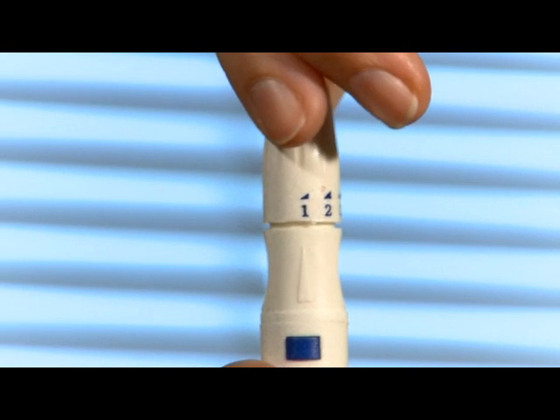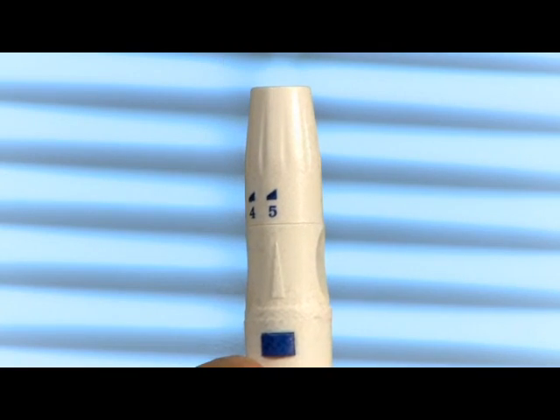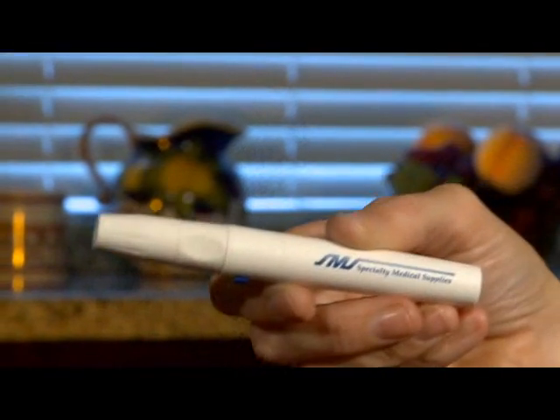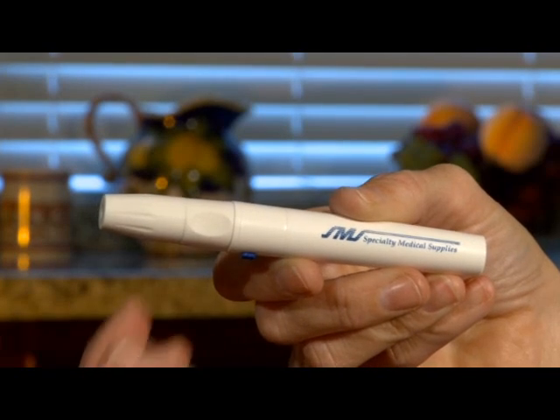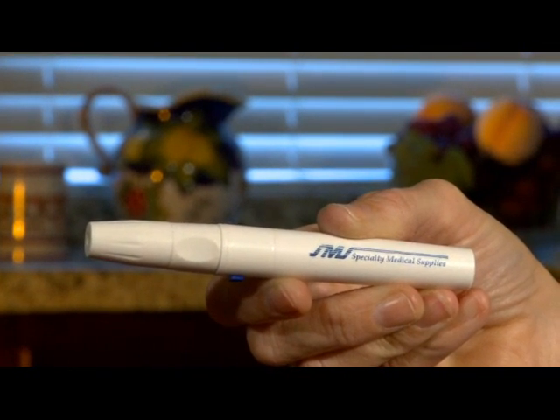Level one for a shallow puncture, three for a normal puncture, and level five for maximum puncture depth. Next, cock the device by pulling the barrel away from the top. You'll hear a click signaling the device is ready to fire.